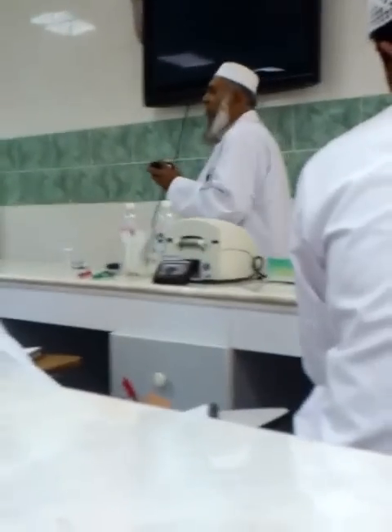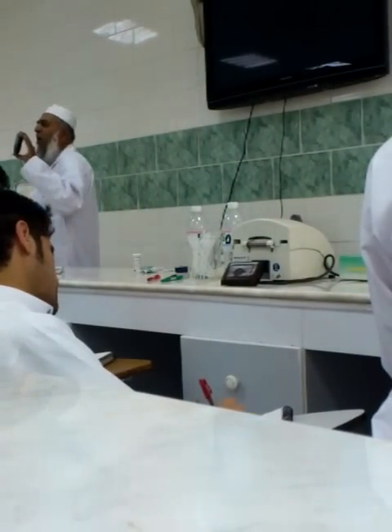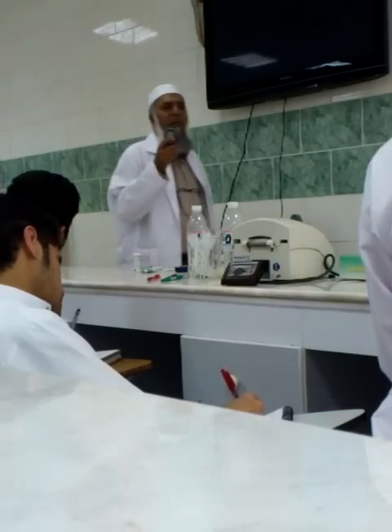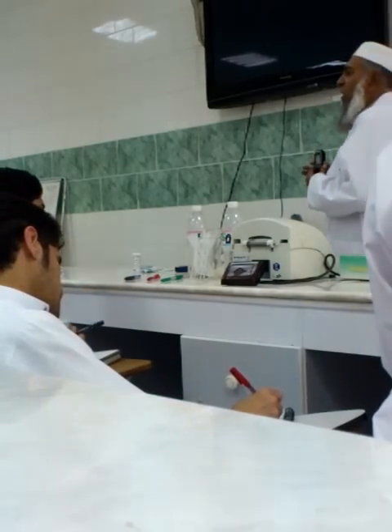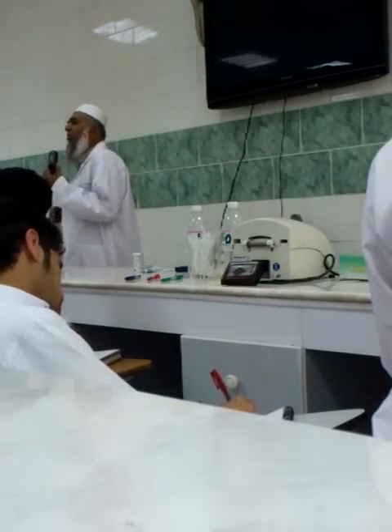The reason is that with the start of use of this glucometer, the measurement of blood glucose level became the easiest way, particularly for the diabetics.